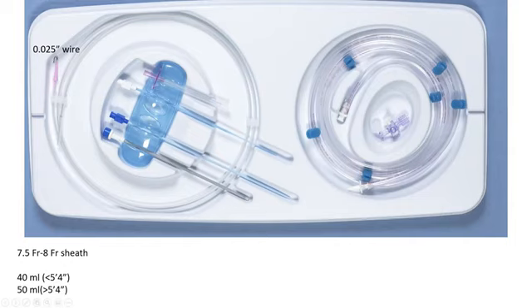Then you have that part, which are the sheath and the wire. So you have the 8 French sheath, and typically for patients less than 5'4" in height, you use a 40 milliliter balloon through a 7.5 French sheath. For over 5'4" in height, it's a 50 milliliter balloon through an 8 French sheath. So this is the sheath, and this is the wire. Now this wire is for advancing the balloon pump. It's that 0.025-inch wire.